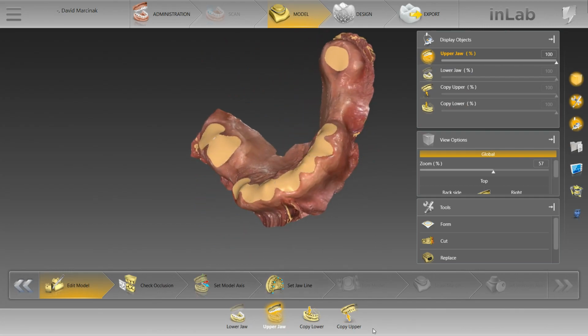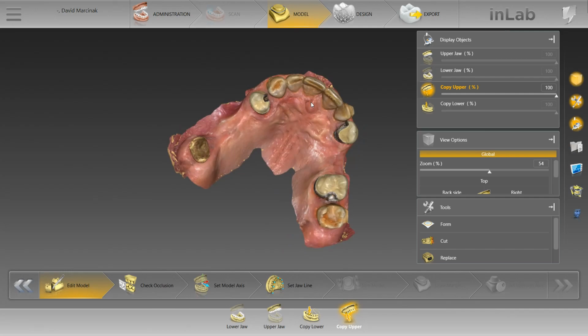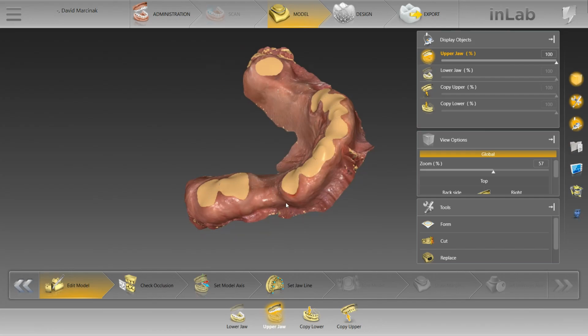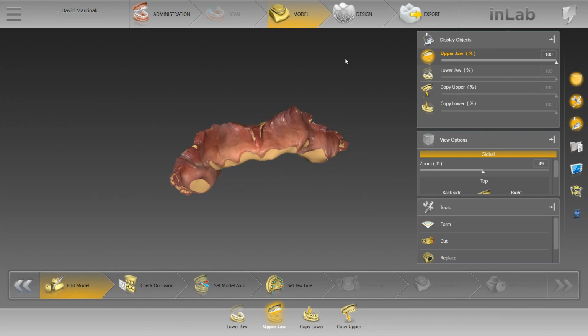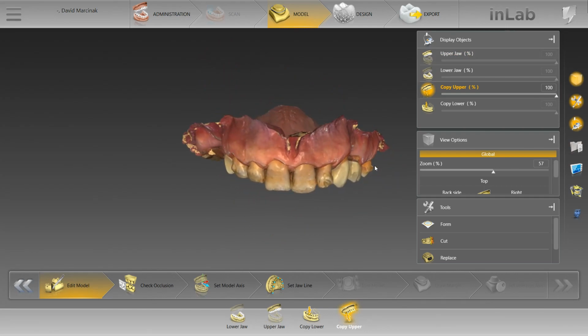All you have to do is copy and paste the scan into the biocopy catalog. What that'll allow us to do is still be able to see where the teeth are, where they're positioned, how big they are, how small they are. You can see all of that still when you overlay the biocopy scan onto the upper jaw or lower jaw, because to virtually prep, in the edit model phase, you're going to click replace, and you're going to go around each tooth and replace that tooth. And after you replace it, it's going to pretty much take it down to nothing. So, in order to make a predictable diagnostic wax-up, you're going to want that biocopy scan, just so you're not making anything that's not realistic. Also, the biocopy scan or the pre-op scan is good for referencing adjustments that need to be made.